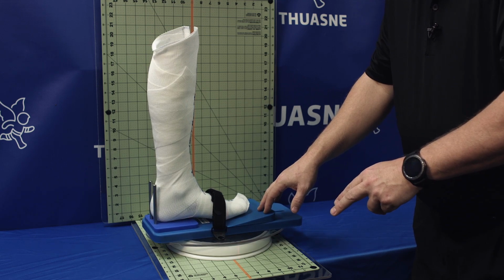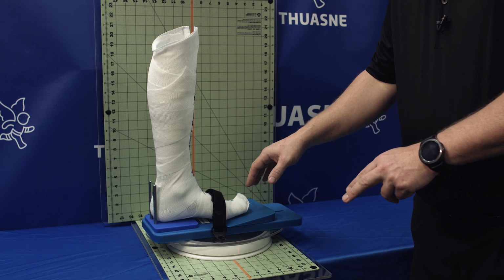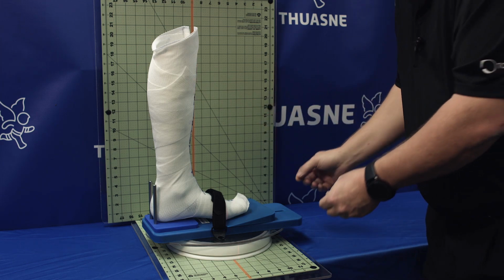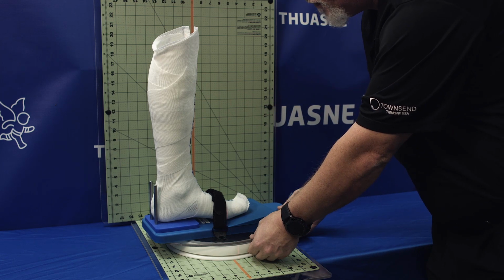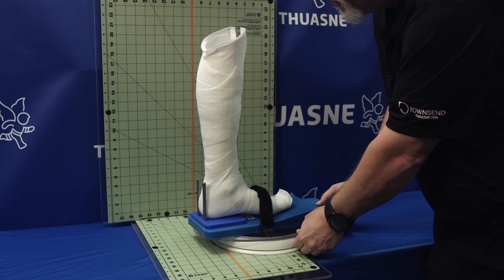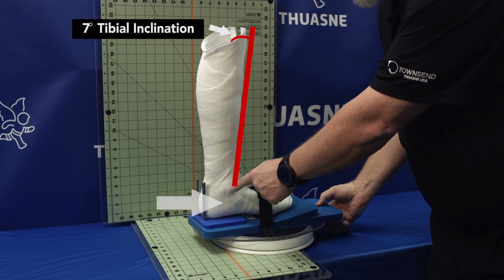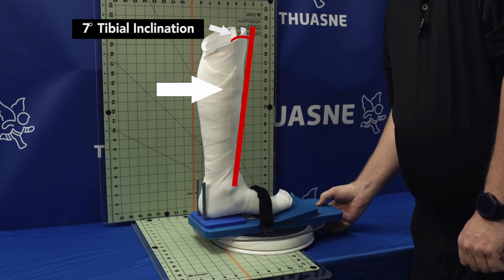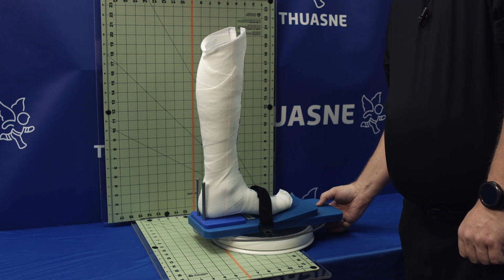So now we know that the hind foot is aligned correct, the forefoot has great alignment, and the last thing that we're going to check is sagittal alignment and make sure that the tibia has a 7-degree inclination based off of the heel wedge. So we'll just slide this over and you're going to be able to see that we're at the center malleoli, we're at center of the calf, so this is properly aligned in the sagittal plane as well.